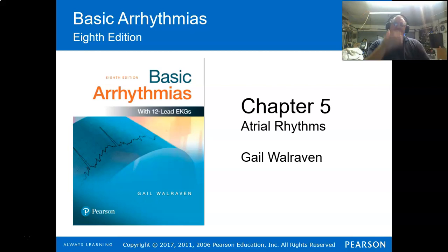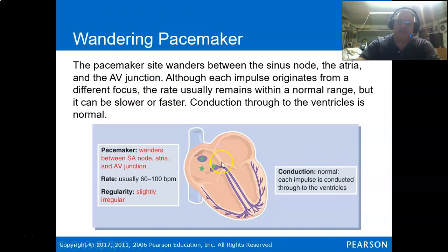We want to think: is it coming from the SA node, or is it coming from somewhere else in the atria? It's important, again, to understand that. So again, the wandering atrial pacemaker. Now this one will drive you nuts, I will tell you that right now.